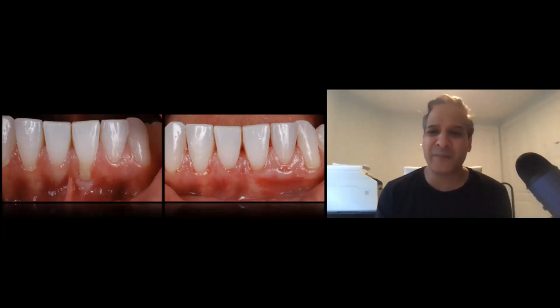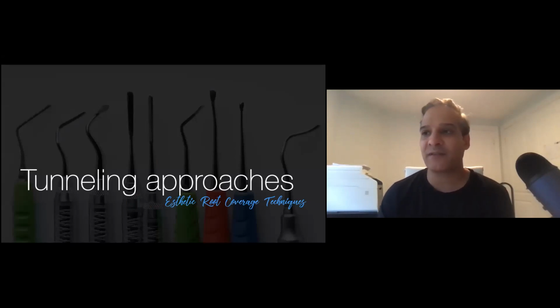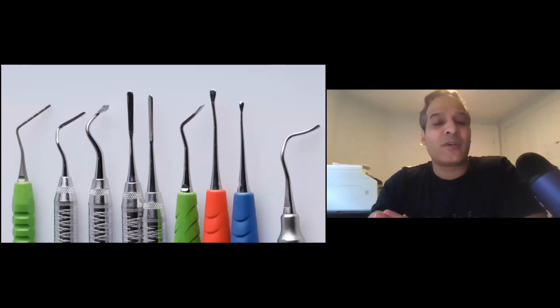You can see a little bit of mild ledging. I'm picky, so I look at these little things, but patients don't care. Again, this is one of the drawbacks of these. You're making a lot of incisions, so you do get these indentations and scarring sometimes. So, the tunneling approach. Tunneling is my favorite way to treat a graft, because when I treat the site, I want to make sure that it doesn't look like anything was done. I'd like it so no one can tell the graft was done.